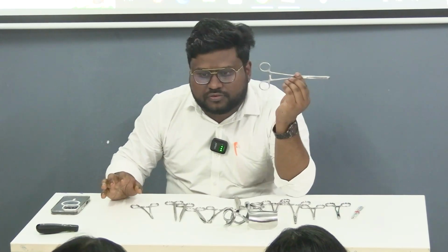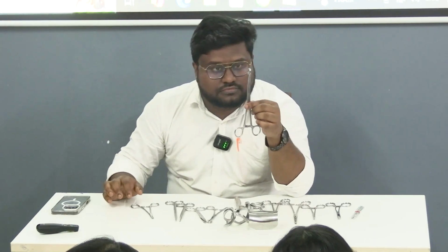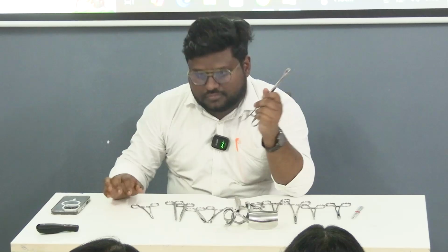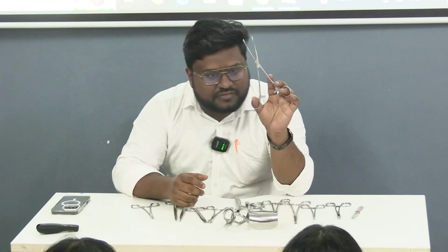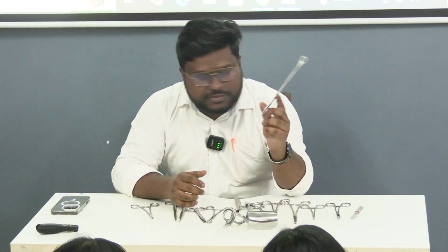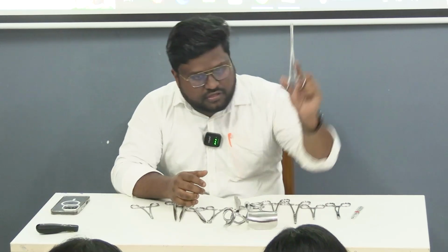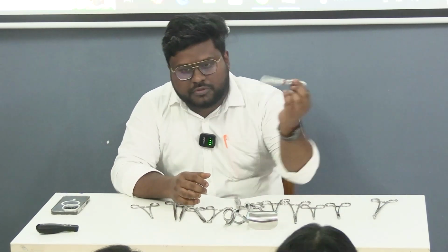What is this instrument? তোরা ফাইনাল ইয়ার, এরকম করলে হবে না। হ্যাঁ, this is a sponge holding forceps. This is the first instrument that we require. কি করব এটা দিয়ে আমরা? Antiseptic dressing and draping with either betadine or chlorhexidine. ঠিক আছে, first instrument. Second instrument কি? This one. What is this?